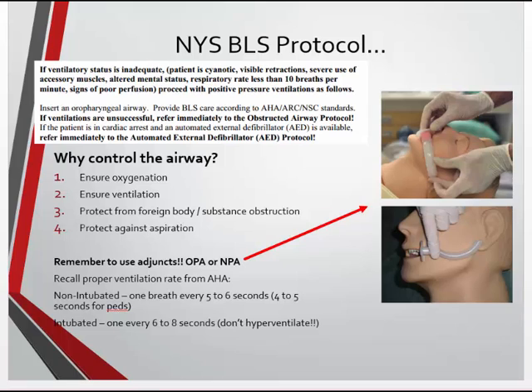Please remember to use the adjuncts. It's one of the most forgotten things that paramedics have going on because they're concerned about getting the tube and they don't always use the adjuncts. So OPA, NPAs, remember to put those in there. Basic people, you can save your paramedics by making sure these go in. That's your job. So help out there and get the basic adjuncts out. If you're bagging somebody ventilating, see if you can get one of these in there.